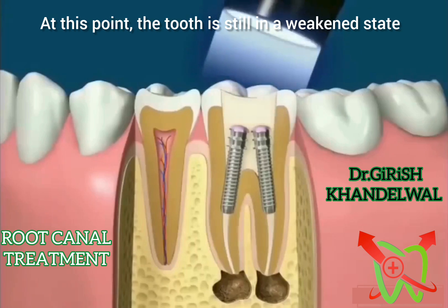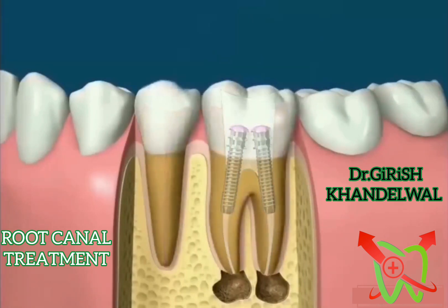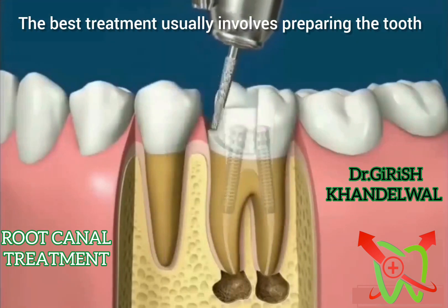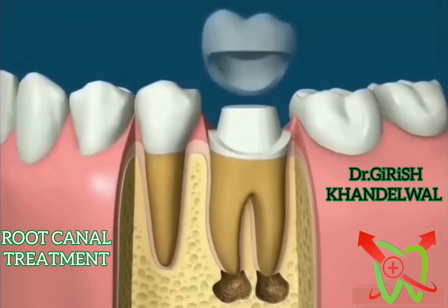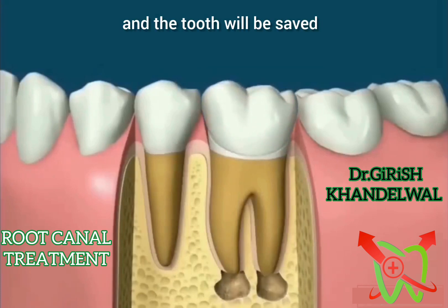At this point the tooth is still in a weakened state and can break with heavy biting. The best treatment usually involves preparing the tooth and covering it with a full crown, sometimes called a cap. Any pathology at the tip of the root should disappear with time and the tooth will be saved.